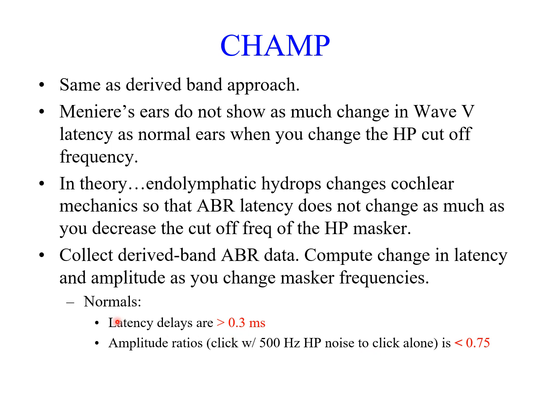So again, these are some basic ideas and explanations for CHAMP. CHAMP is a commercially available package that you can buy in Biologic commercial ABR systems.